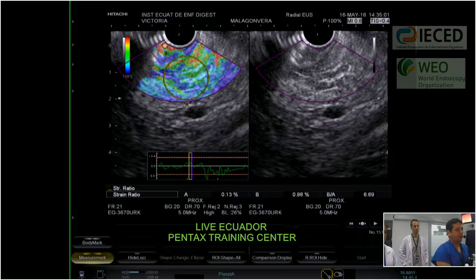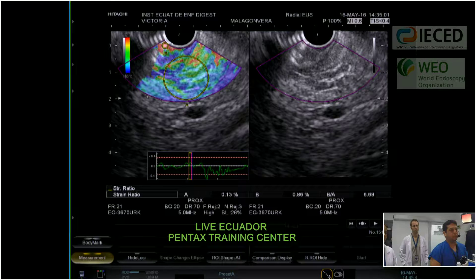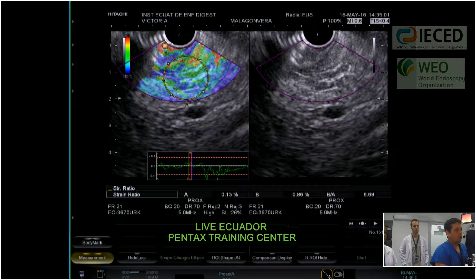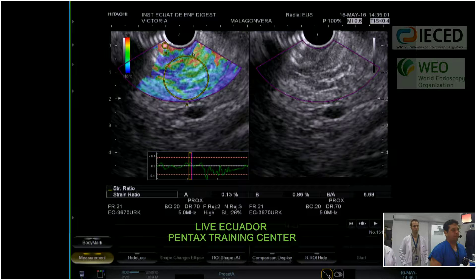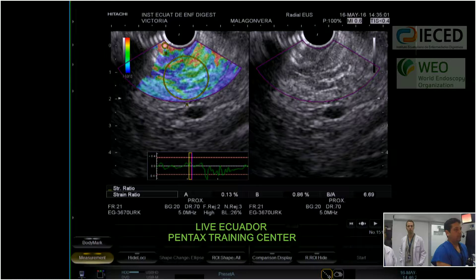We are now performing an elastography of this area. This is a qualitative endoscopic elastography. Looking at the colors, we can see some blue areas and some green areas, which could represent the characteristics of fibrotic alteration in the head of the pancreas — corresponding to the fibrotic areas already shown in B-mode.